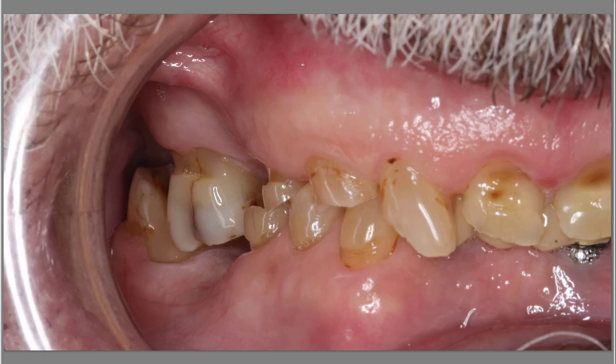He'll have to be opened back up. We have to confirm his vertical dimension and centric relation, and get our implants in the correct positions.